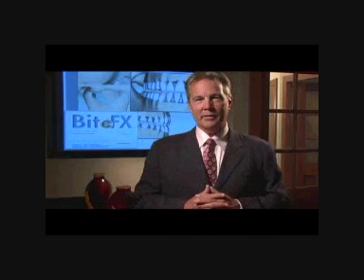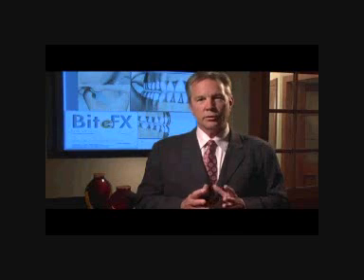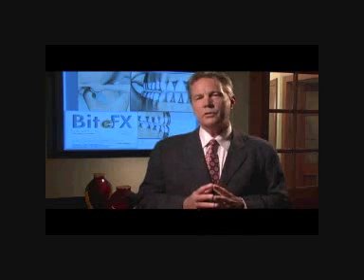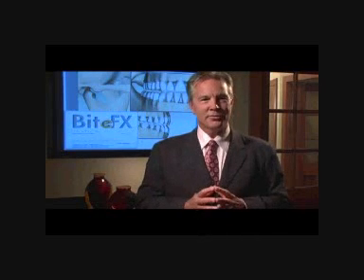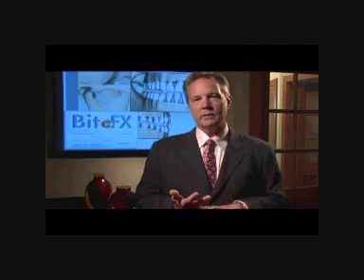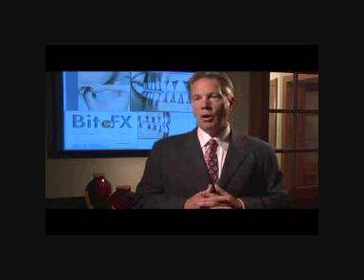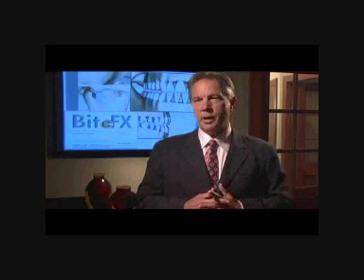Sometimes I don't use BiteFX. If a patient's healthy and stable, there's no occlusal disorders, there's no need to. Most of the time, I see occlusal disorders. I see wear, looseness, fracturing teeth, sore muscles. And I use BiteFX always at the post-examination interview.